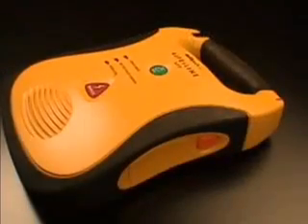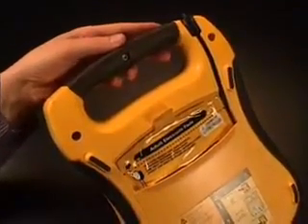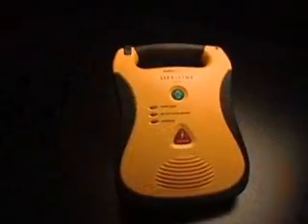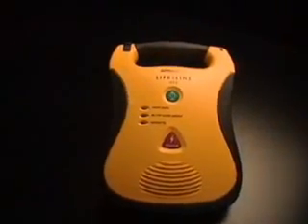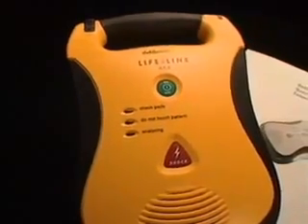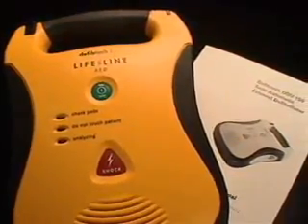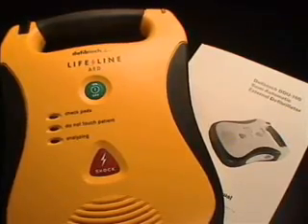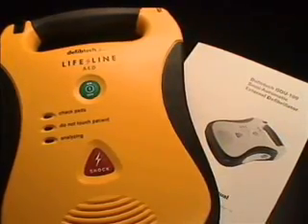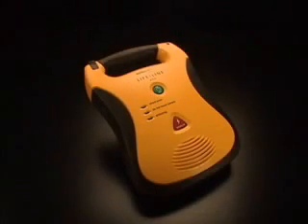The Lifeline AED should be kept with the battery pack inserted and the pads connected and stored in the pad holder. The unit should be kept in a readily accessible location with the active status indicator visible. This video presents only a quick overview of the Lifeline AED. You should refer to the user's manual for more detailed information about the unit. You should also get comprehensive AED training before attempting to use the Lifeline AED. With sophisticated medical technology this simple to use, now anyone can save a life.